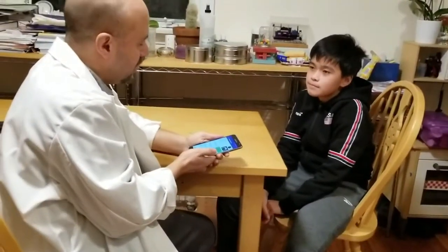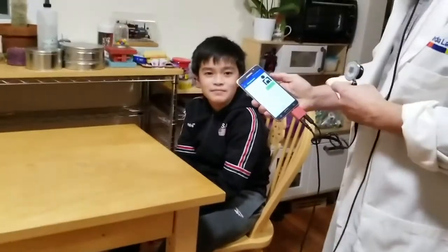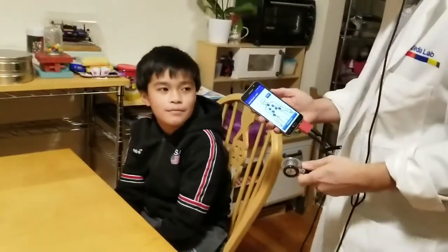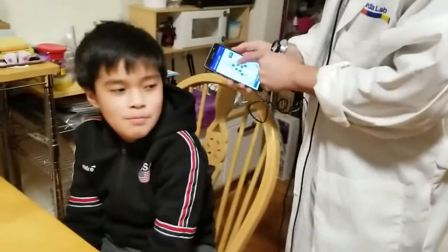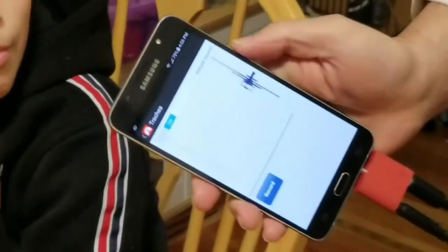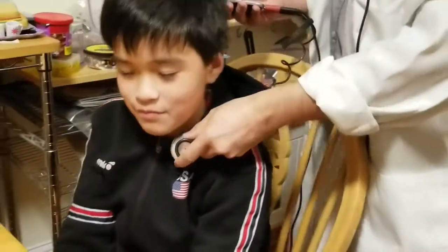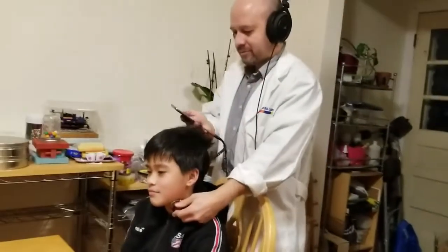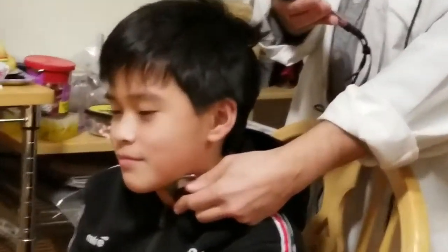Next, I'm going to listen to your lungs and see how that sounds, okay? So, okay, so first we're going to listen to your trachea. Okay. Now take 5 deep breaths. Breathe in, breathe out.